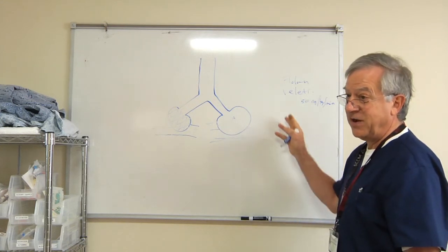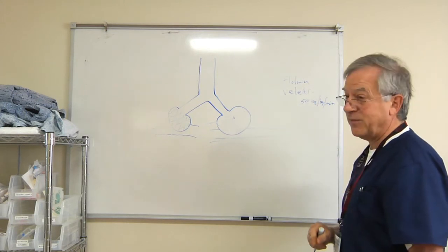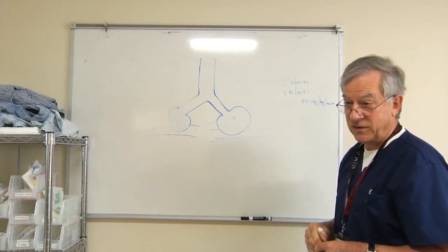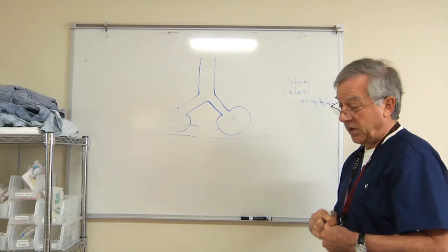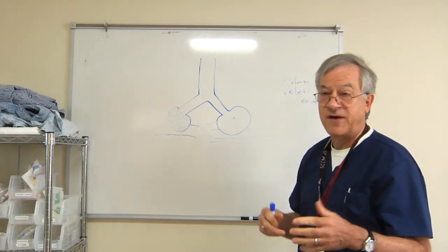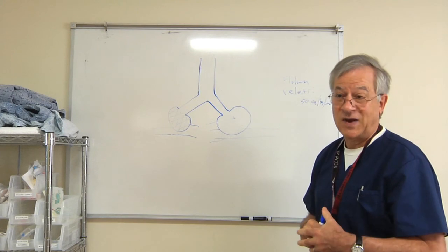And so we would administer that in line with a nebulizer at 50 nanograms per kilogram per minute, and then taper it down once the oxygenation for the patient improves. This has been used extensively at Highland for many years, and again, it's one of the tools that can help us reduce the FiO2 for these patients and buy time to allow the lung to heal.